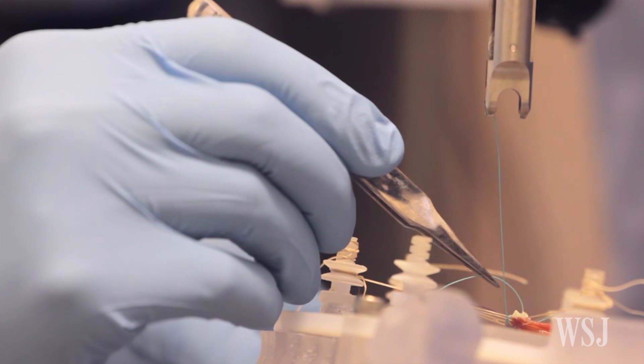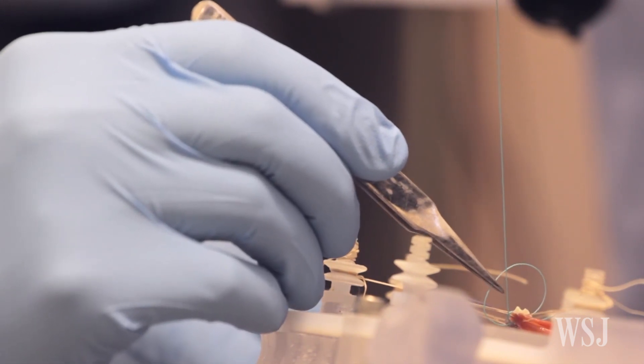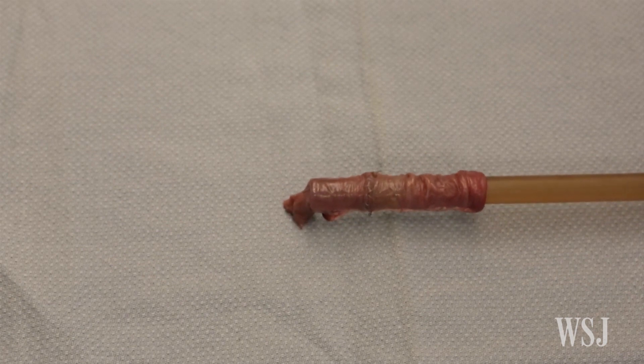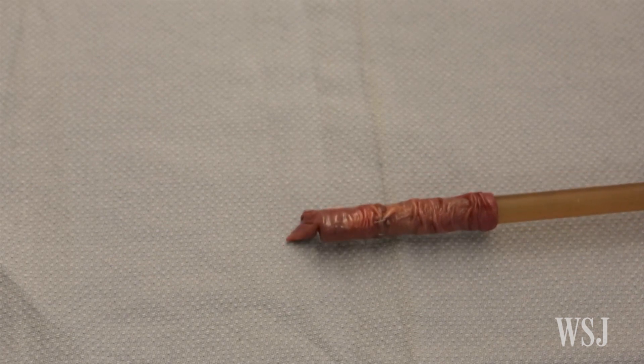Progress has been made for automating hard tissue surgery, like bone cutting. But soft tissue has proven to be a challenge because its malleability makes it more unpredictable.